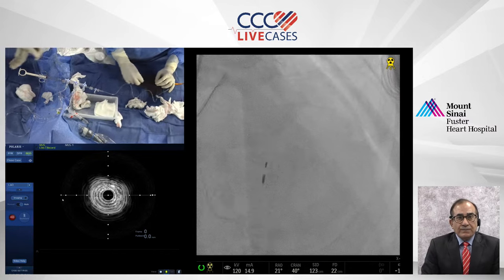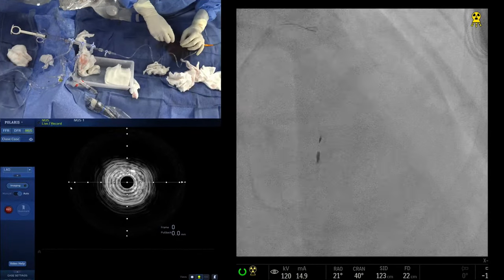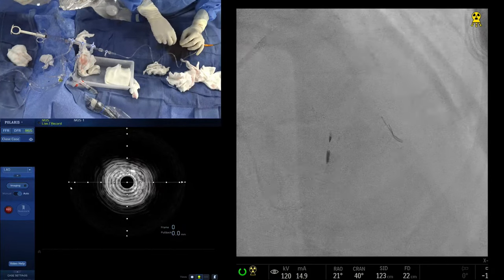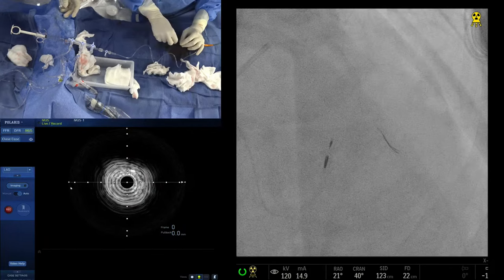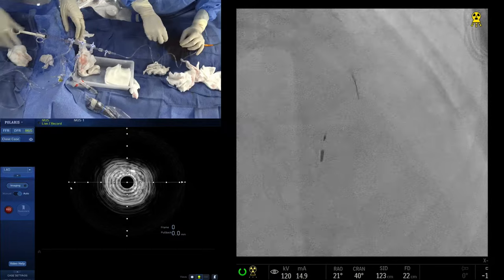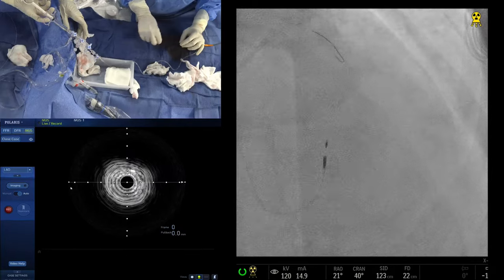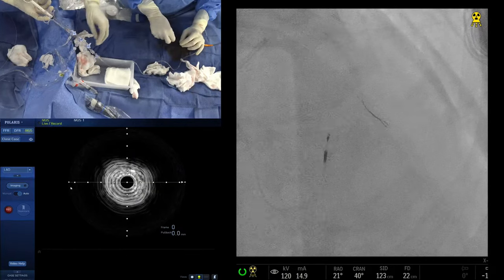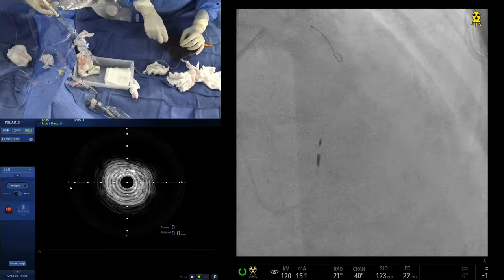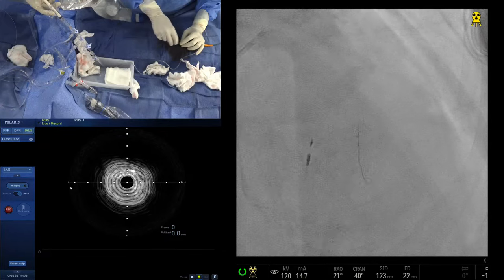Okay, what are you doing now? IVUS, yes. They're just going to show the IVUS, and then I'll finish my take-home message and the three questions. Some dye. Remember, there is a moderate lesion in the mid LAD, which we have not tackled. It's going to the diag now. No, it's not the diag, it's the mid LAD. It's a small branch. See that it's going into that small diag. Give a little dye. I think just do the half if you need to. No dye. Okay, now we're good.